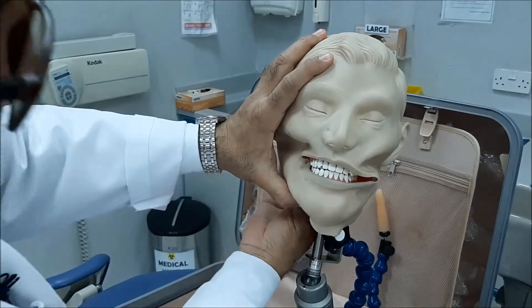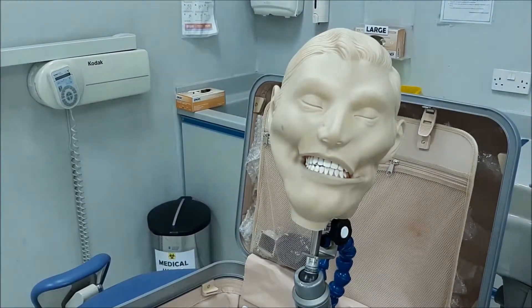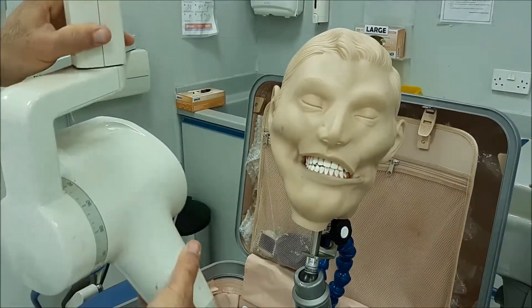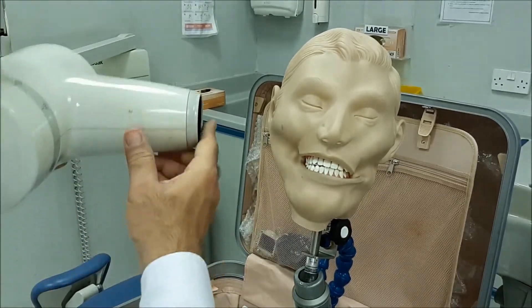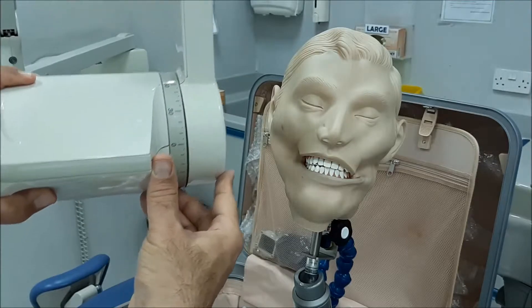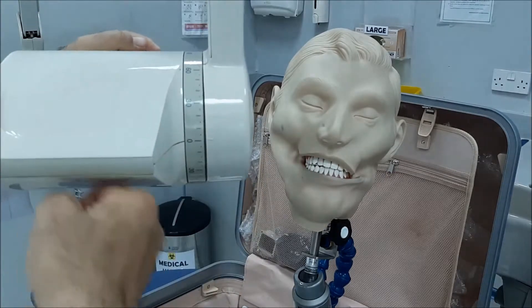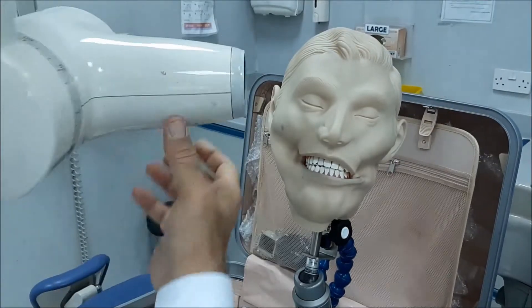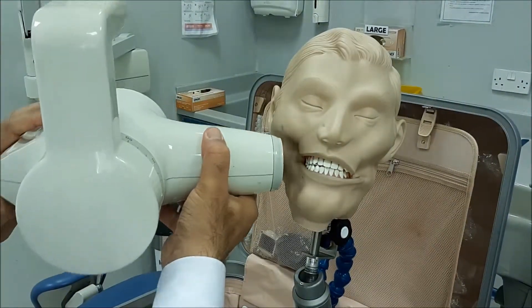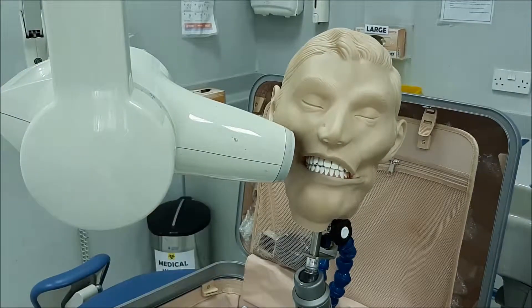Now let's discuss beam alignment — how we direct our beam for this type of radiograph. There are three important things to take care of. The first is vertical angulation. For all radiographs using this technique, you give a plus 10 degrees — directed downwards. This compensates for the tilting of the film that results from the patient biting on the film.